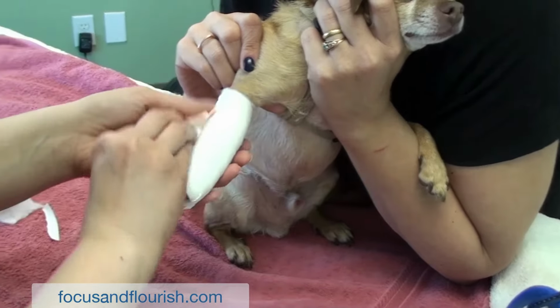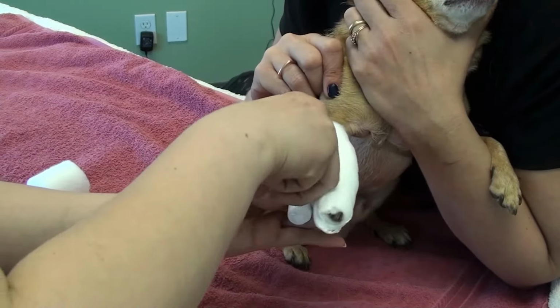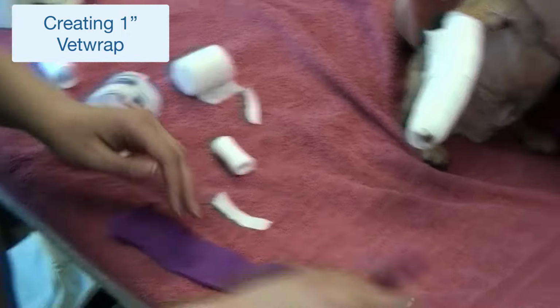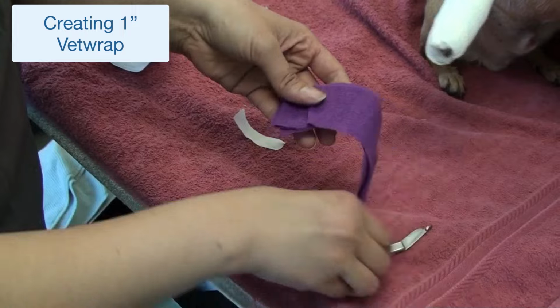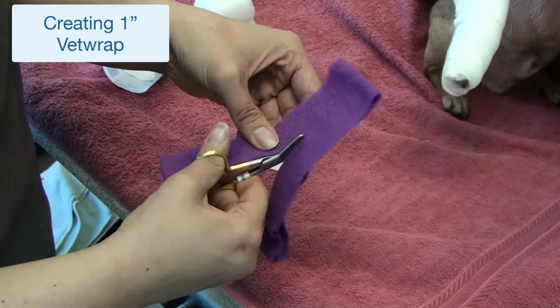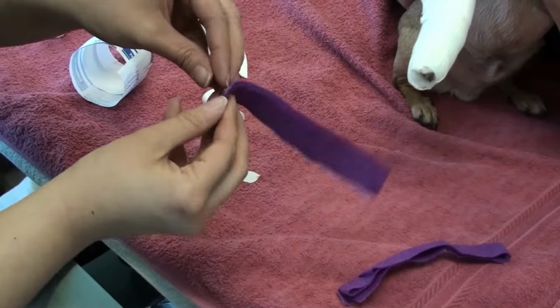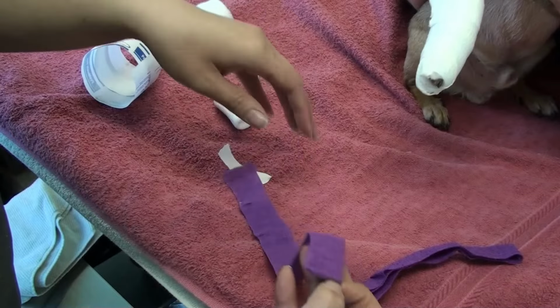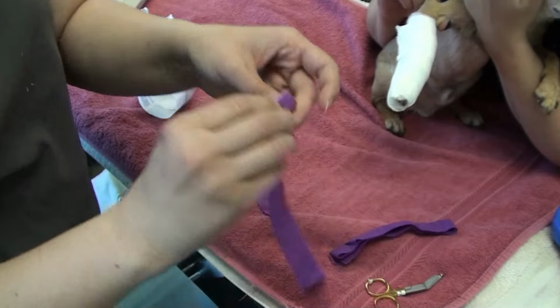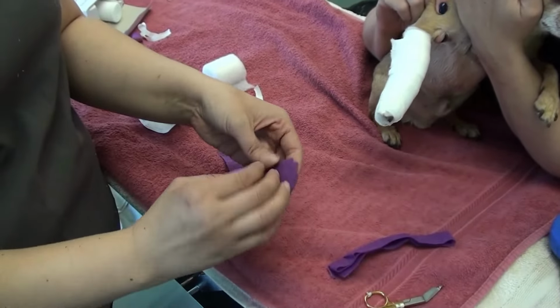The next layer will be the protective layer, or the Vetwrap, and 2 inches is usually the shortest we have, which tends to be big. So Jen just pulled a strip of the 2-inch, folded it back and forth, and now is cutting it in 2, which gives her 2 strips of 1-inch Vetwrap. She'll then take that strip and make a little roll out of it, which makes the whole thing just more manageable and easier to apply to the limb.